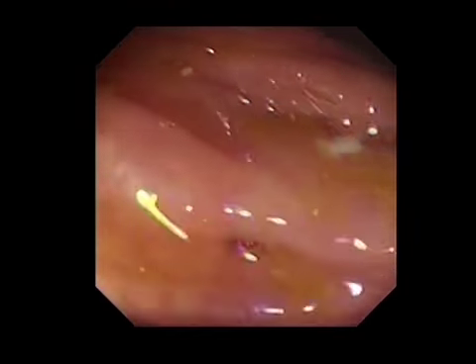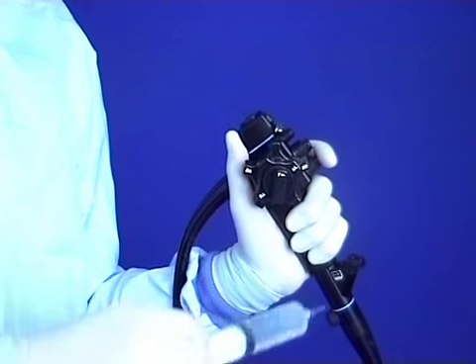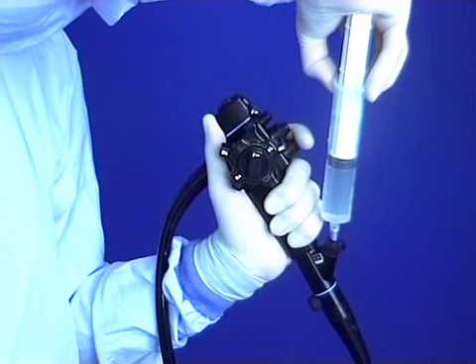Adhesions from previous hysterectomy or diverticulitis can cause fixation and difficulty. A paediatric colonoscope or even a paediatric gastroscope makes things easier. Even so, the view can be very poor. Underwater endoscopy occasionally helps in diverticular narrowing or stricture, water holding the folds away from the lens and giving a better view.